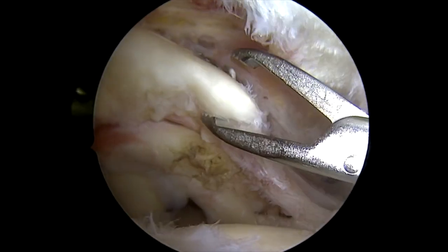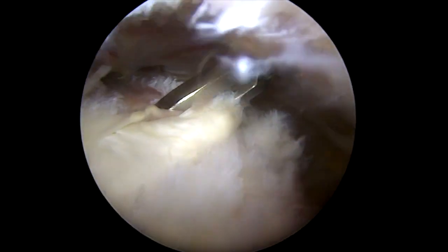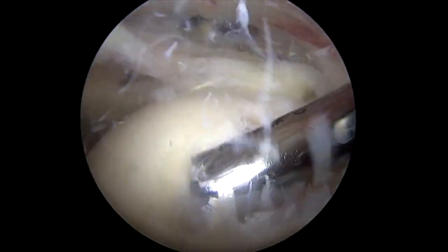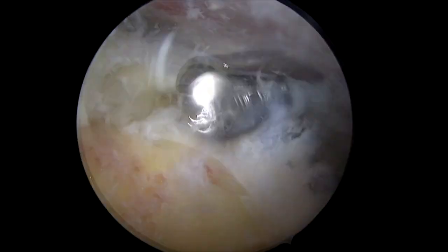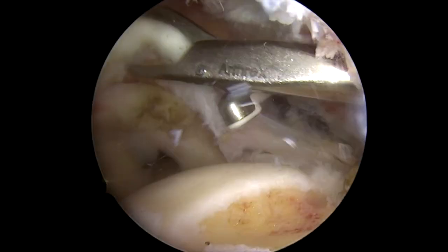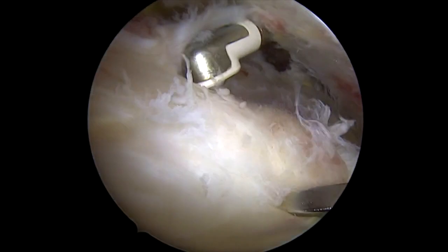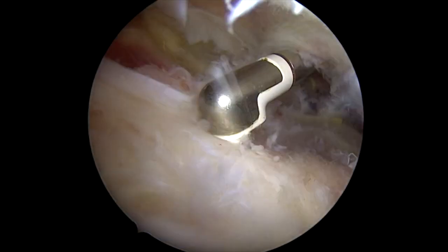Make sure we've got plenty of leeway above the tendon. This tendon comes all the way back down, and I can see that looks like it's going to come nicely into that run little spot there. We're going to debride the tuberosity here and make sure we've got plenty of fresh healing on the osseous surface. And then, once again, make sure that's going to the right spot. What I do here is look at the medial aspect of the footprint and make a mark on the tendon to see exactly where I'm going to want my sutures to pass.